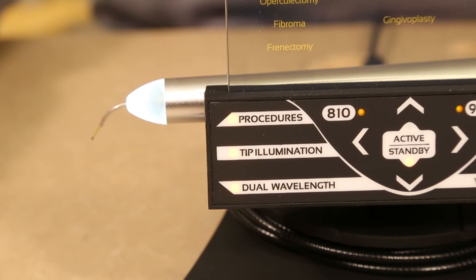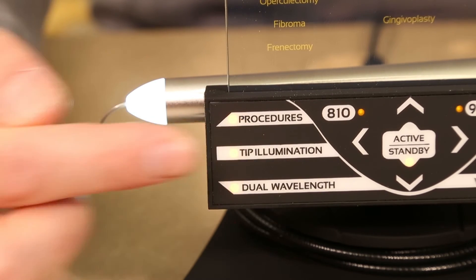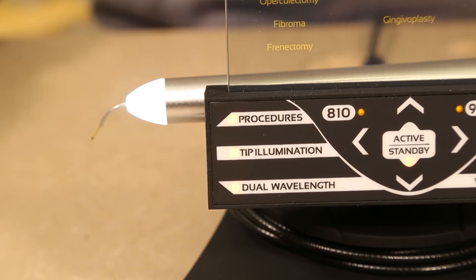To adjust tip illumination, simply press the tip illumination button which toggles between low, high, and disabled.